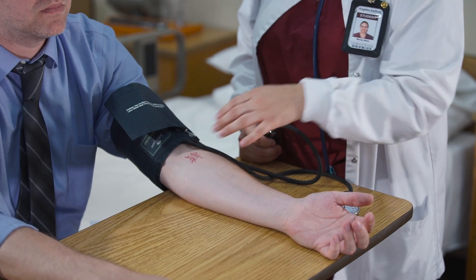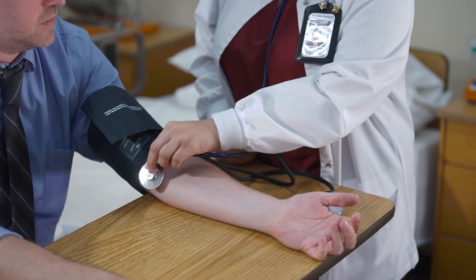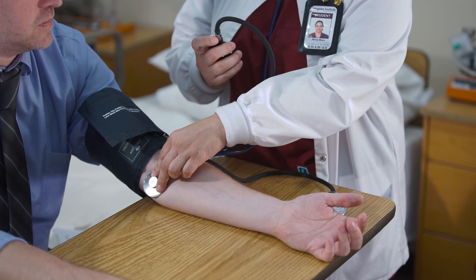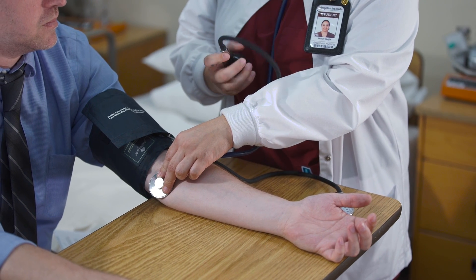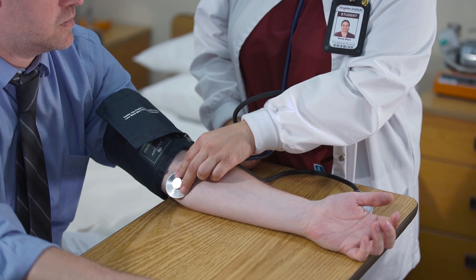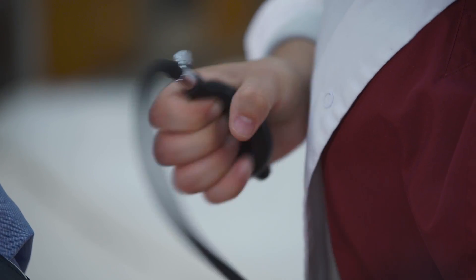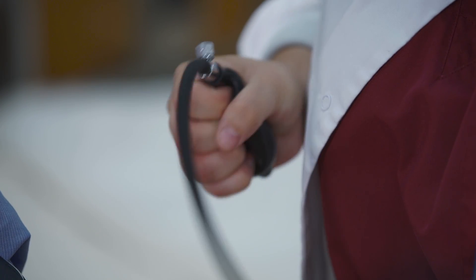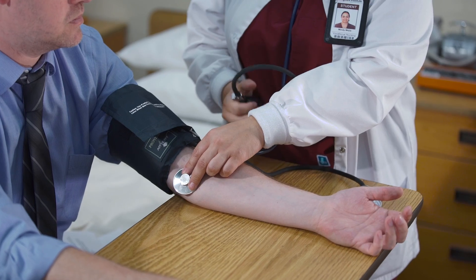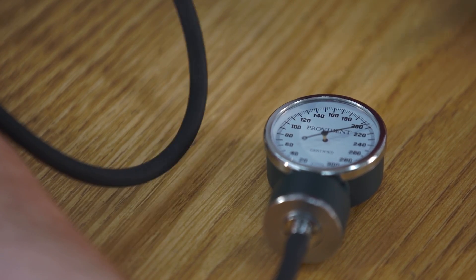Relocate the brachial artery with your hand. Place the bell of the stethoscope over the brachial pulsation. With your hand, turn the valve of the cuff clockwise to close. Compress the pump to inflate the cuff rapidly until the dial of the manometer reaches about 160. If there are any heart complications, it will be safe to pump about 180 to 200, as they might have a higher blood pressure reading.